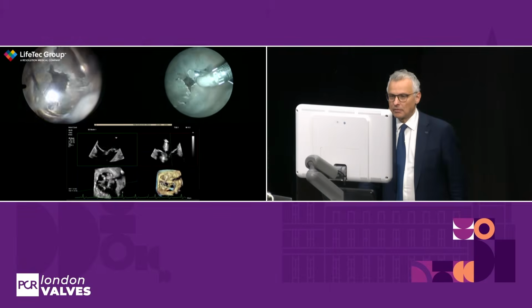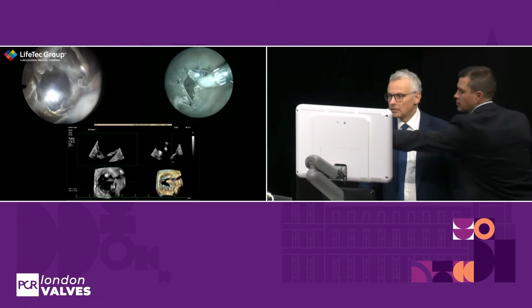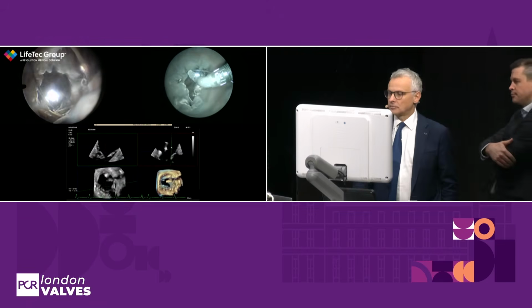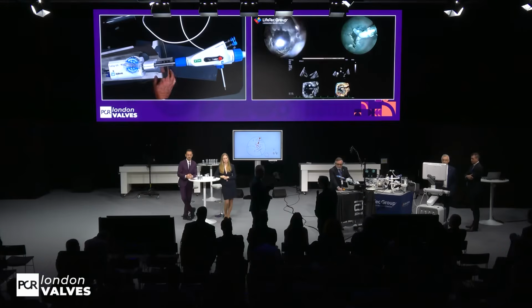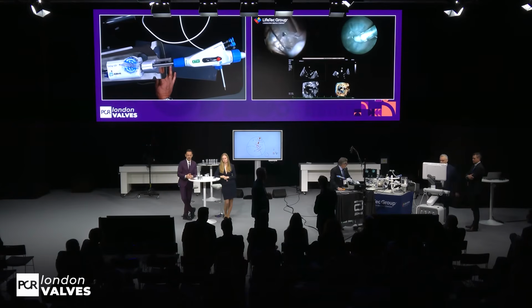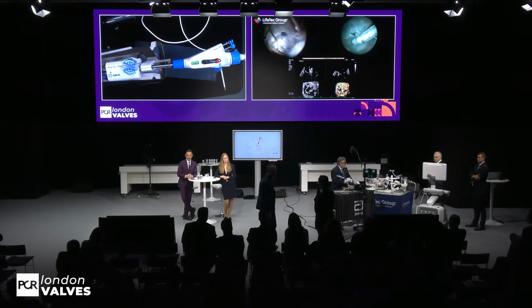We will not move the lead. We agree that we will not try to move the lead. And this is a very important question. We're considering here that it's a TR induced by the pacemaker. So would you still put the first one anteroseptal? Yes, always. Always, even though there's no functional component. We care about the anatomy, so we start with the septal and the anterior leaflet. I think it is a rule. I don't know if you agree.